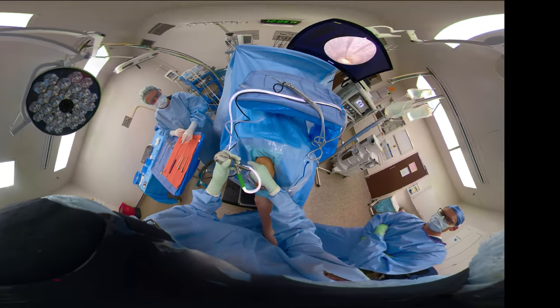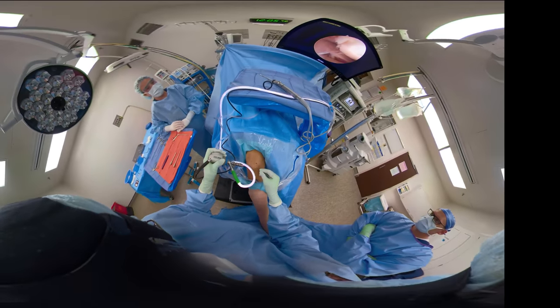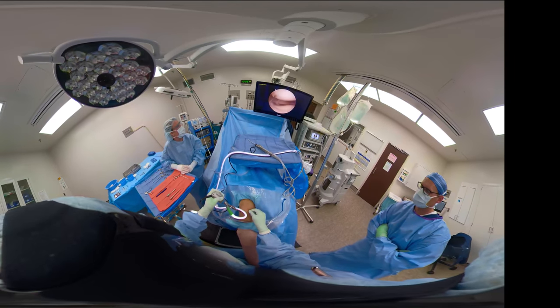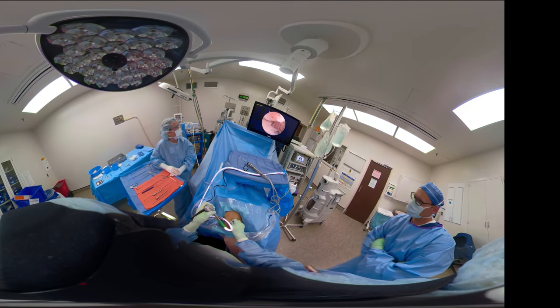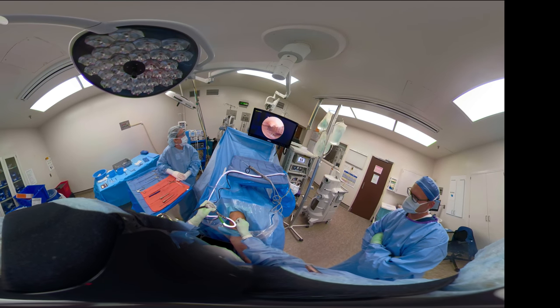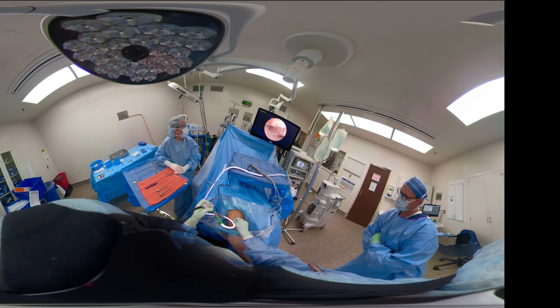Sometimes I'll put a little step up under my foot so I can easily control the leg on my upper leg, and put the probe in the medial compartment or the medial portal. And now we're measuring again how big that defect is. So it's a 20 by 10 millimeter defect.